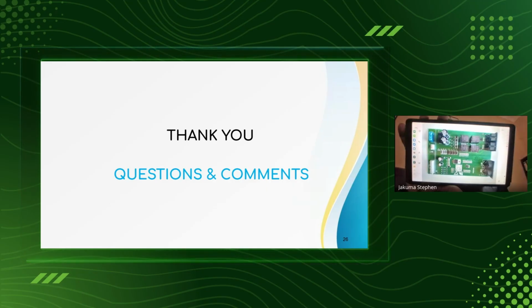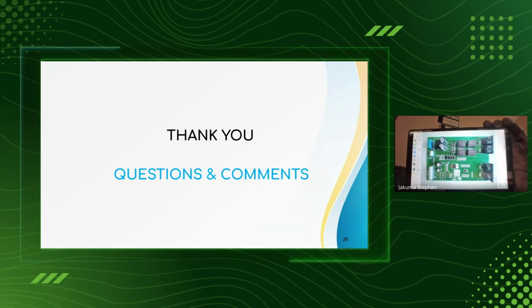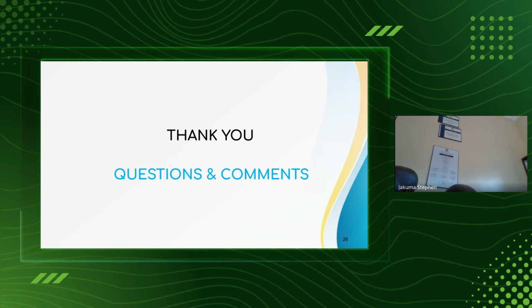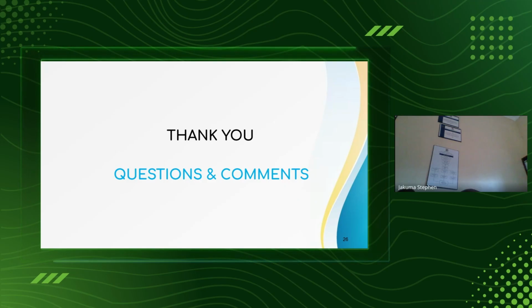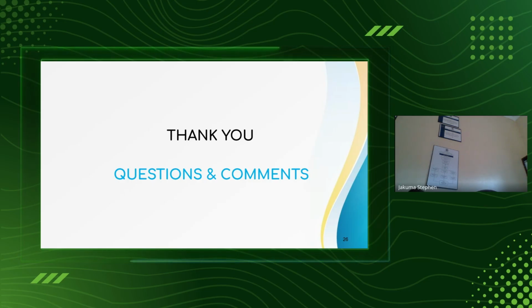It's a common problem actually. Sometimes these machines are from China, and the spares are not easily found. I was thinking, since you talked about the switches, the handy switches for those motions, maybe there could be some maintenance I need to do, but I don't know what kind. When you look at them, they appear to be of integrity. Is there any maintenance that can be done on them if they are loose? No, normally they just short. The problem with them is they just short and then they pass the current. Oh, that is the problem.